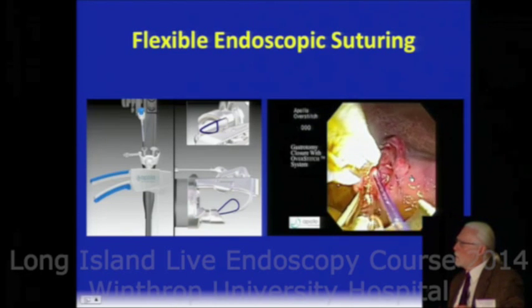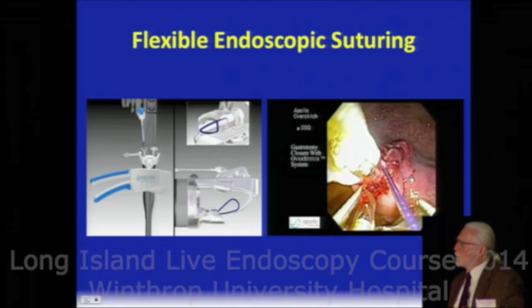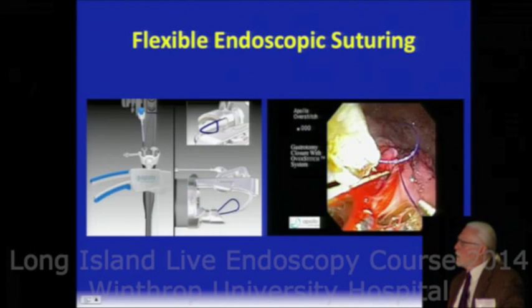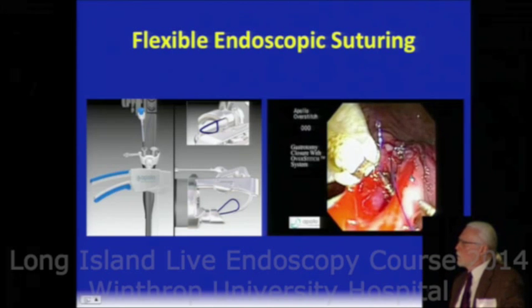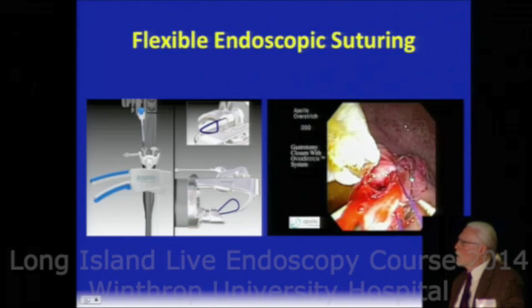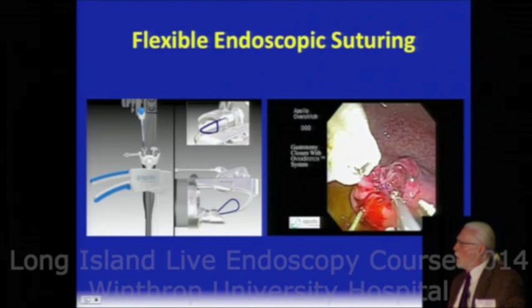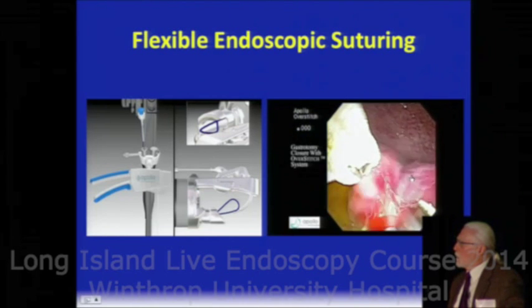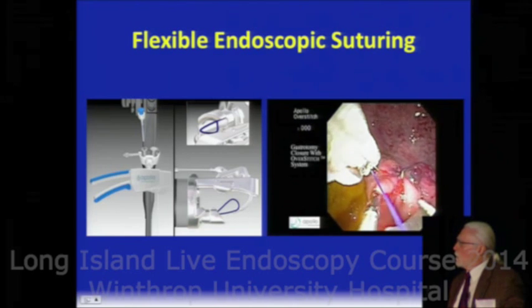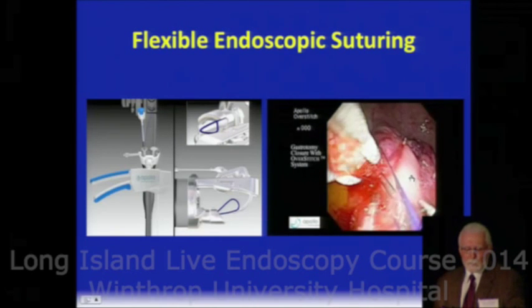Here we're getting towards the end of that suture line. We call this a dog ear down at the bottom, where there's always a little space or an opening that you have to watch for to make sure that gets closed. Again, the repetitive process, it's a very simple, clean process of transferring the needle, placing a stitch, reloading, and working your way down the line. Pretty soon we're going to drop this suture, and we're going to cinch it down. That's what you're seeing right here. So here the majority of that opening has been closed. And then we'll finish up at the bottom here with the last little bit that's left.